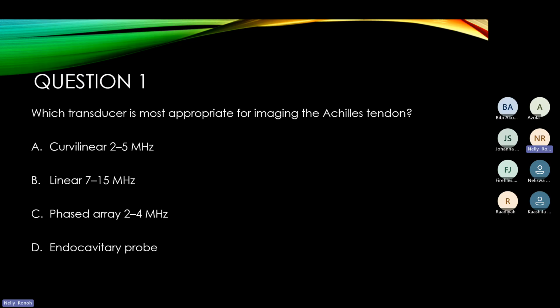They would have that fibrillar pattern. They would be hyperechoic, and anytime you see a hypoechoic appearance, it could be anisotropy, or inflammation, or maybe some chronic disorder in that tendon. How you tell the difference is when you change your angulation.